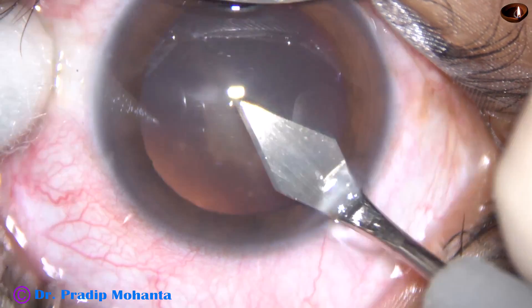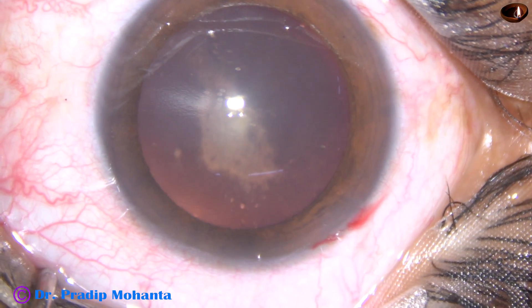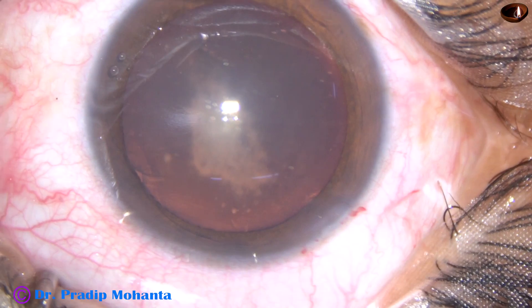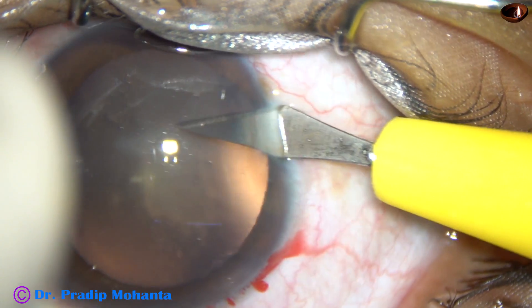I have taken up this posterior subcapsular cataract for surgery. The rest of the lens matter is almost clear. So this is a very soft cataract with posterior subcapsular opacity. Let us observe the surgery.